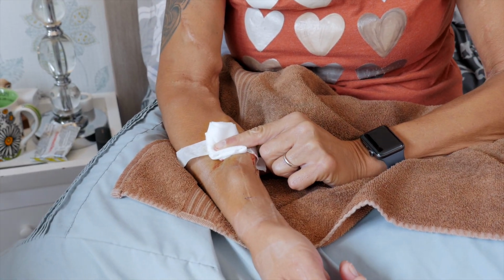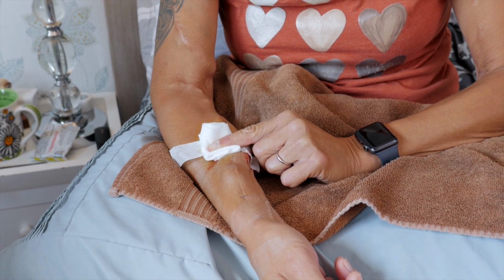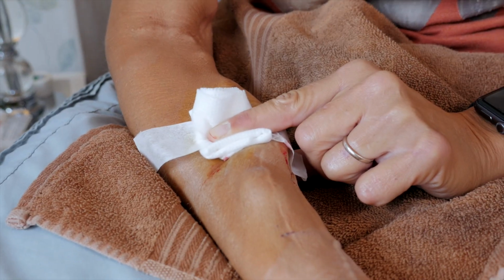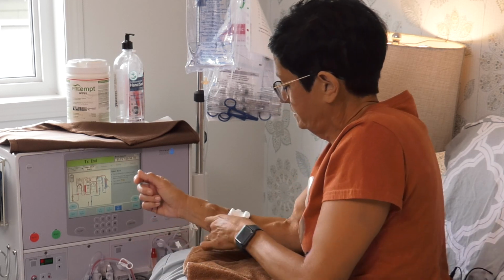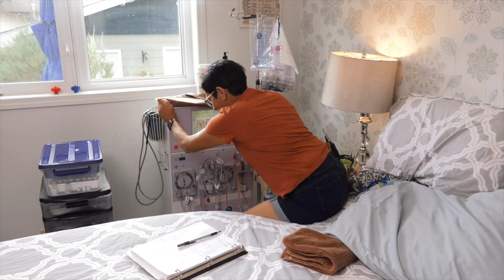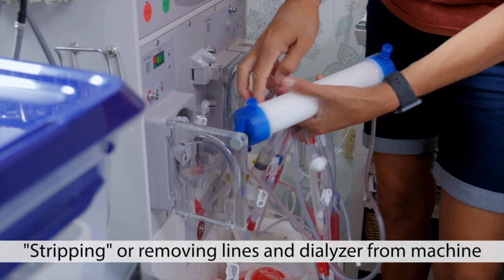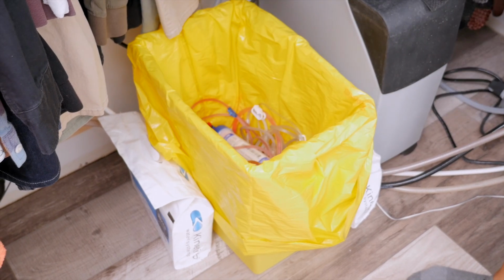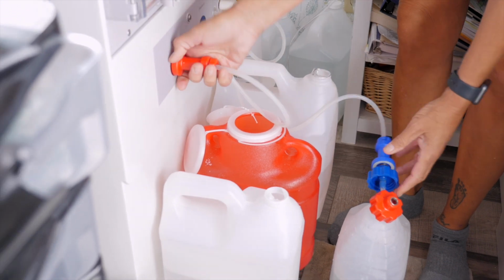You've got to give it a fair amount of pressure, especially mine. My fistula is getting old, so I need a lot of pressure on it. So now I'm done treatment. Hook up your connectors.